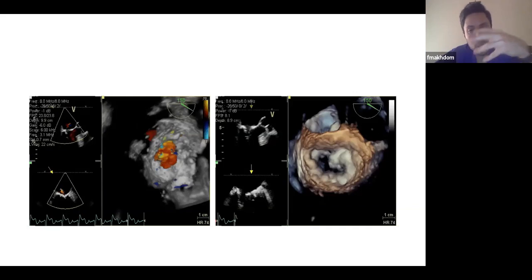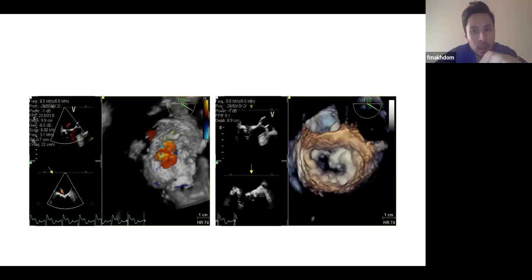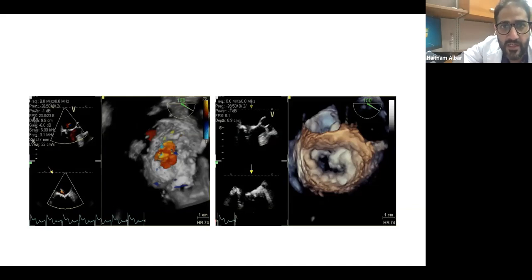Yes, you have to know the technique for mitral annular decalcification, and what the options are to reconstruct it. Sometimes you can take the suture in the calcium itself, but this will increase the risk of dehiscence. For the technique, you just need to be meticulous with the debridement, and at the end you apply the patch on it.